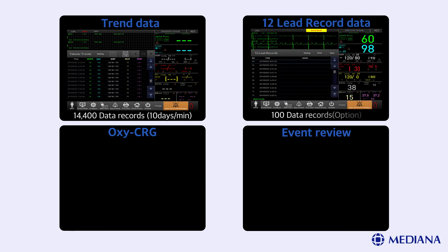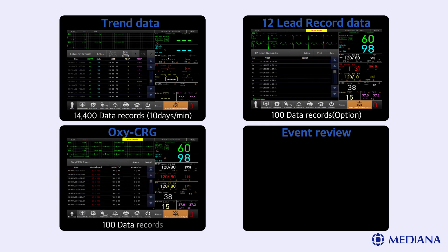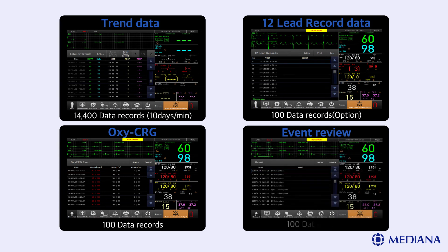For 12 lead record data, the monitor displays 10 data on screen and 100 records can be saved. For OxyCRG, the review screen shows the heart rate range and SPO2 range. If you change the screen into event list, it shows other features. For event review, the data can be saved before and after an event occurs.